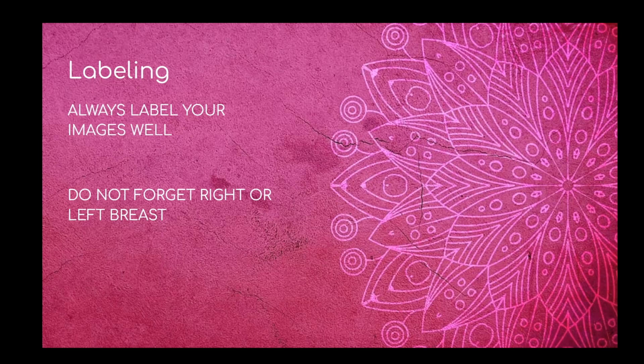You've got diagnostic mammograms all day, and you don't have time to fit in a biopsy. They're extensive in time and resources, and most places don't have same-day appointments for them, but they will fit them in the next day or two. So that patient's going to be out and about, coming back, positioning has to be accurate again, and we need a good roadmap to find that lesion again.